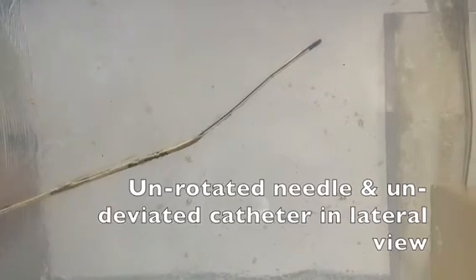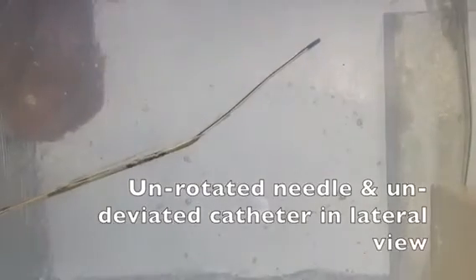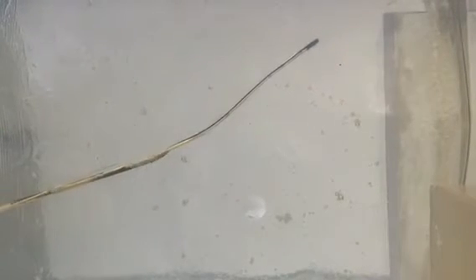And then I withdraw the needle by holding tight the catheter.